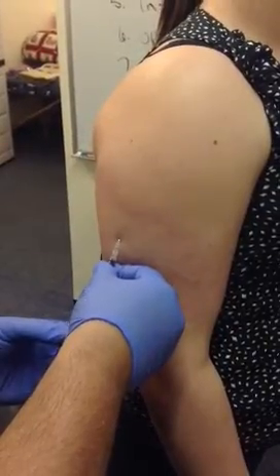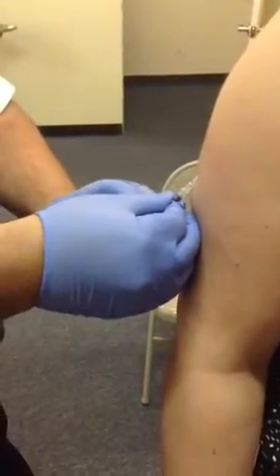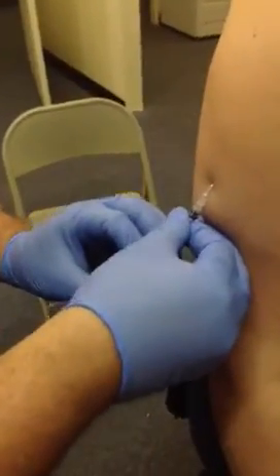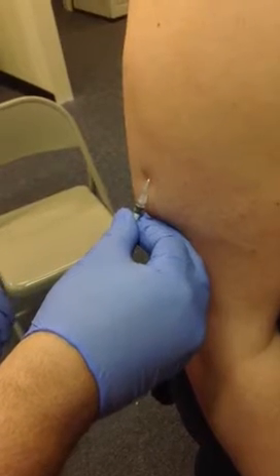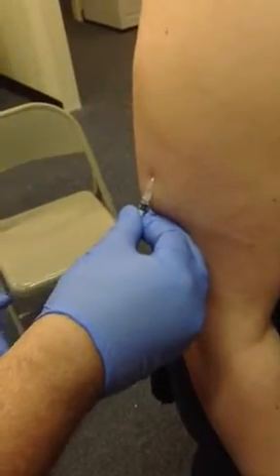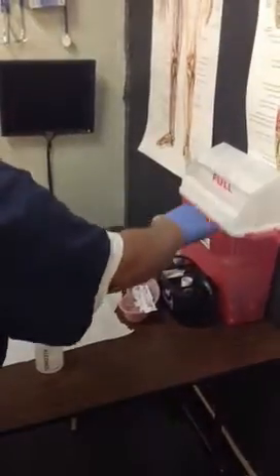Once you're in, anchor your fingers down to the arm and hold very steady. Pull the plunger back just to make sure you're not in a vein, then inject the medication. Hold your hand very carefully and very still. Now pull the needle out by going straight down to the ground — don't come toward you, go straight down — and pull the needle out. Separate your hands immediately and get rid of your needle by tossing it into the mouth of the sharps container and then lifting it up underneath.